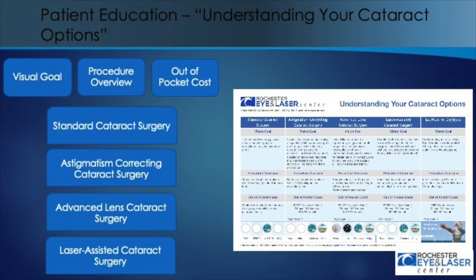So the first category is just a standard cataract surgery. That's manual surgery, and that's putting in that monofocal lens, okay? Does it make sense to everybody? If you didn't get a sheet, we could get you one, to visualize it.